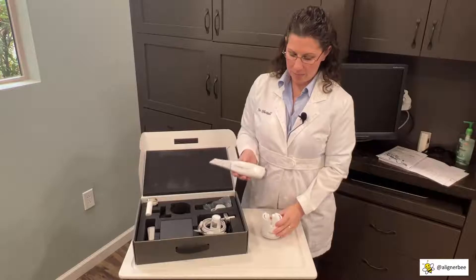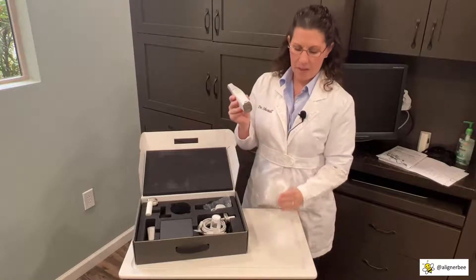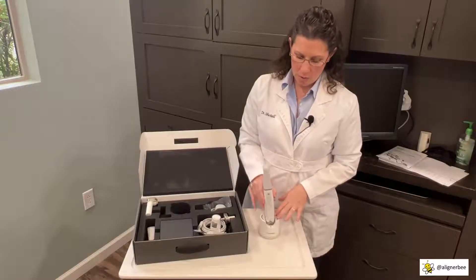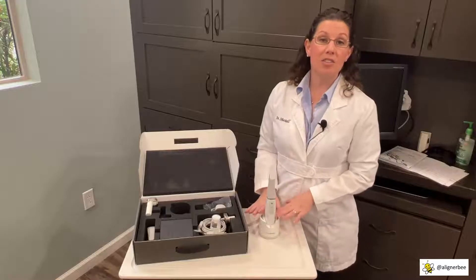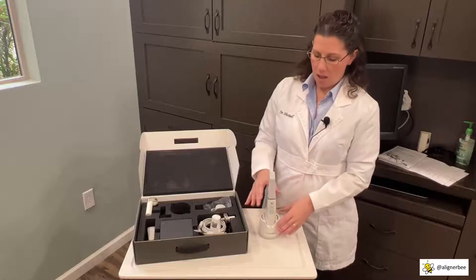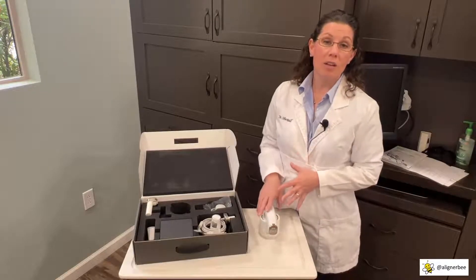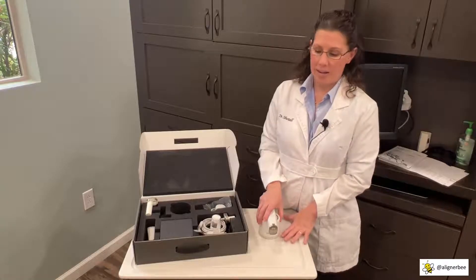With the cradle, there is a diode connection on the wand and one in the bottom of the cradle. When the cradle is attached to a power source, we place the scanner in the vertical position to begin charging the batteries. If you want a break between patients, you can lay the wand in the horizontal position and use it as a holder so you're not setting it on a bracket table.